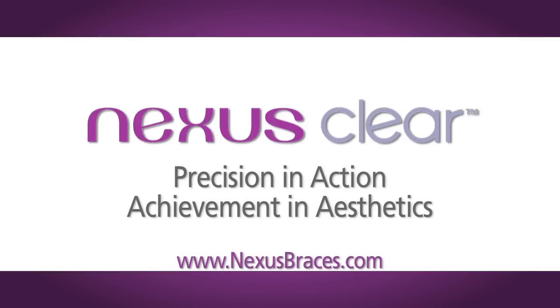When it comes to true innovation, look to Nexus Clear. Precision in action and achievement in aesthetics.